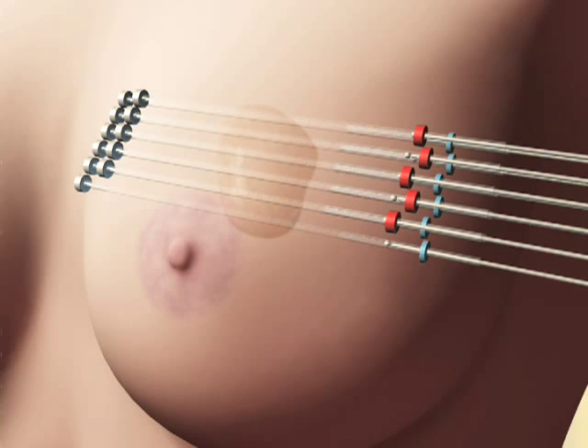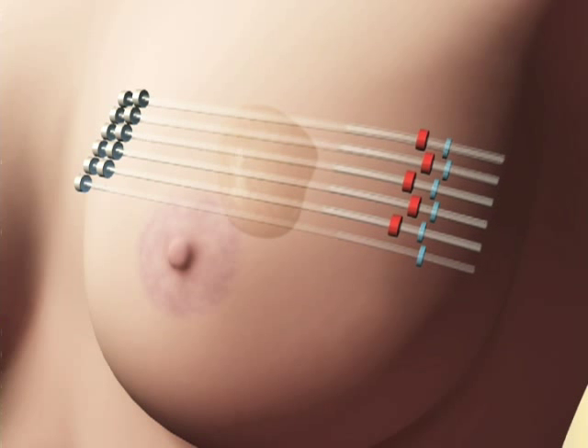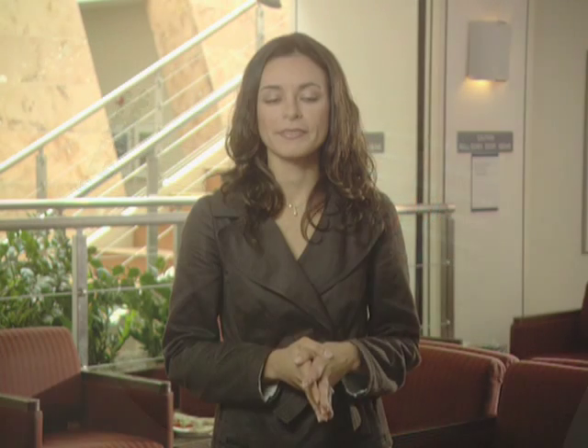The patient goes home after each treatment and wears a special bra to keep the catheters in place. This form of treatment is called brachytherapy.